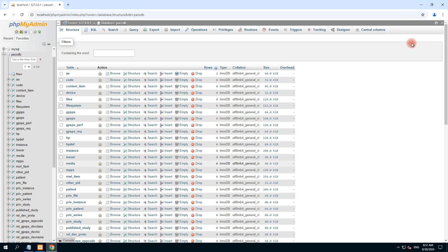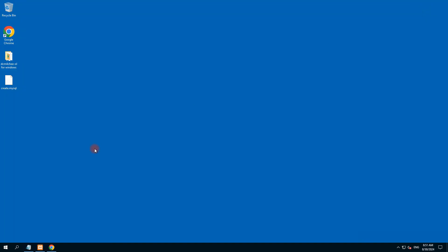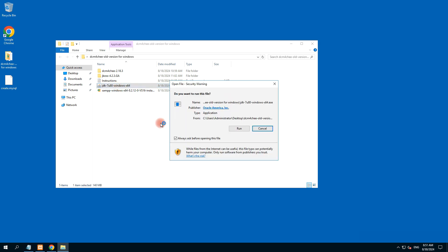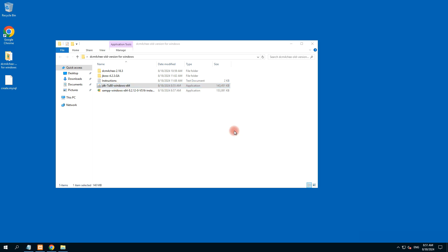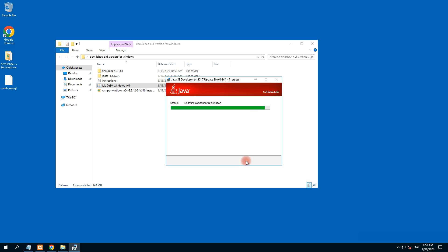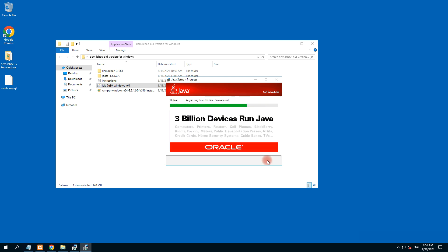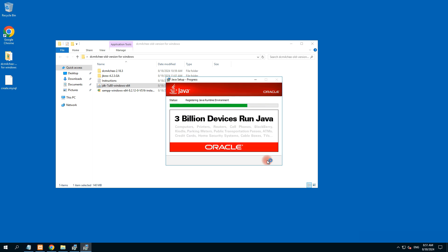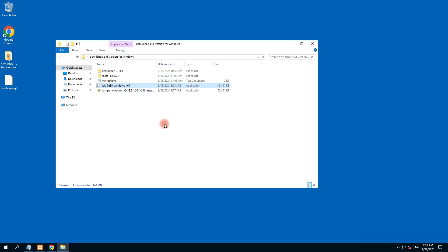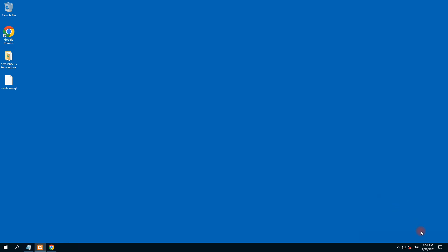Now we need to install Java. Double-click on the Java installer, run, next, next — it's installing. All these files are in the folder. Click next and close. Now we head to the second step.